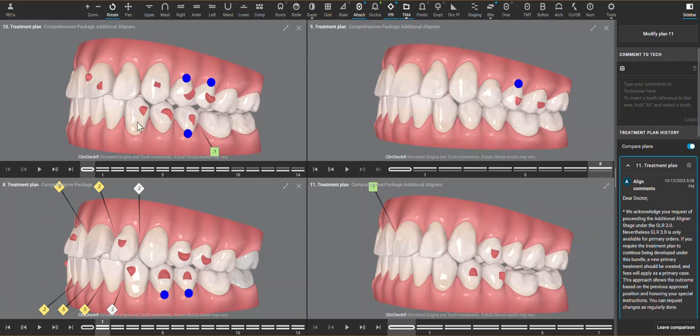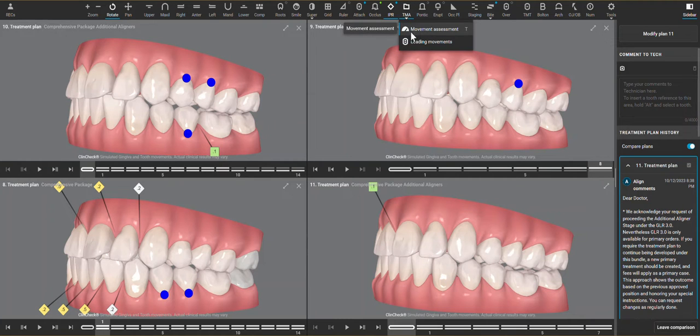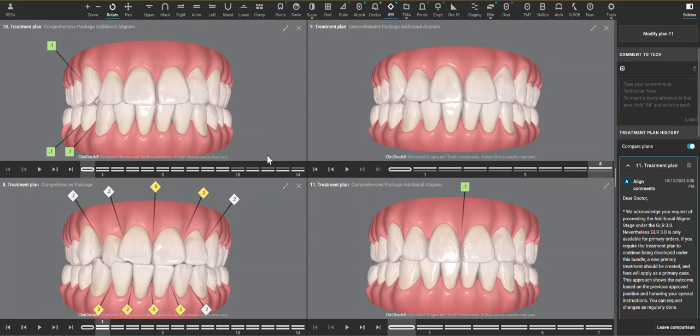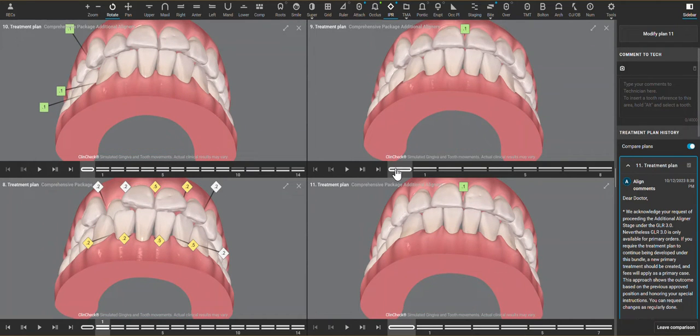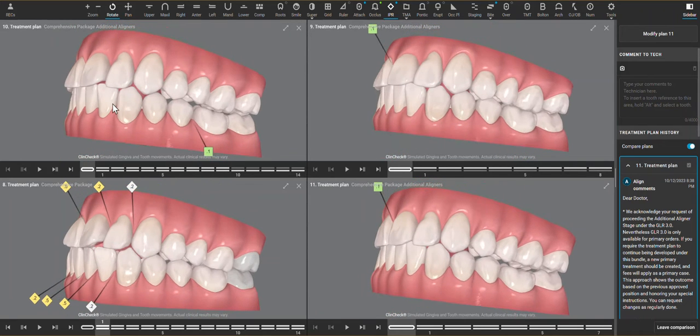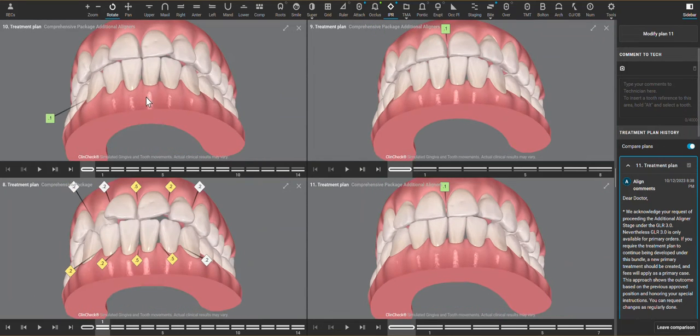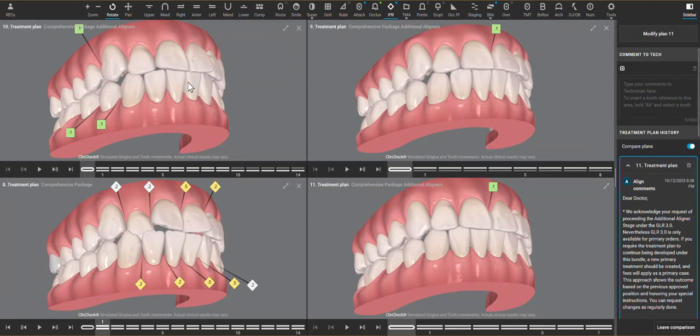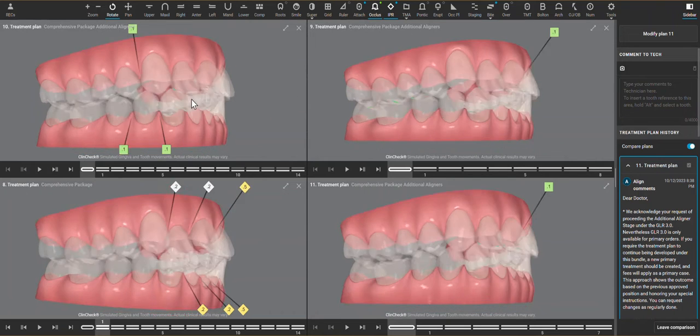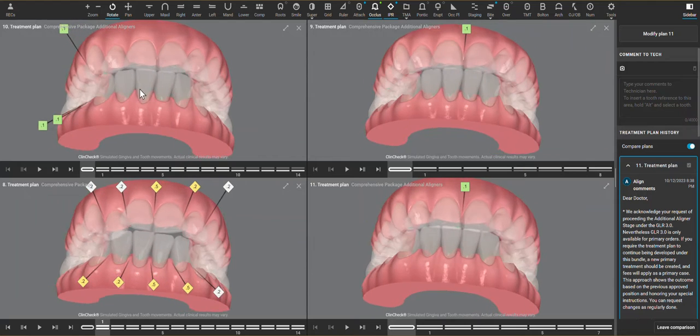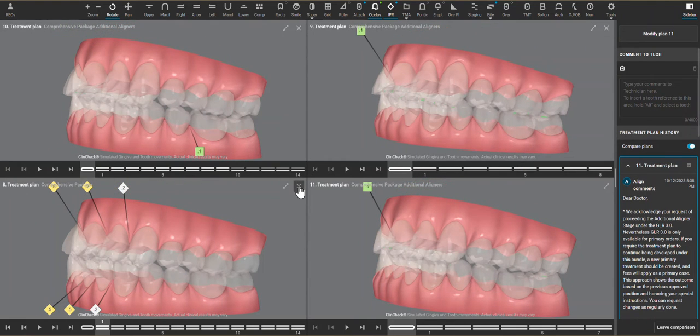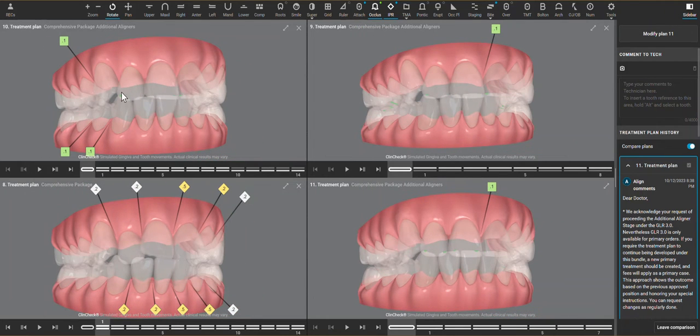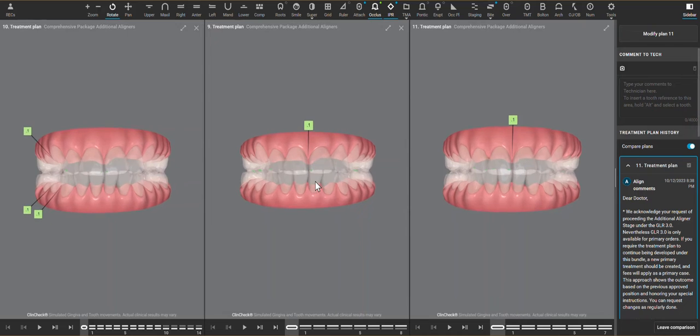Let's take a look at treatment plan number 10. From treatment plan 9 to treatment plan 10, I'm also thinking that the patient maybe didn't wear the aligners very well or something occurred, because we see a lot more rotations of the anterior teeth and then really the posterior open bite starts to present itself. Now we have an anterior interference here and there's one here, and I think those are the main contributing factors to the entire posterior open bite, is that all the teeth are hung up in these anterior contacts.